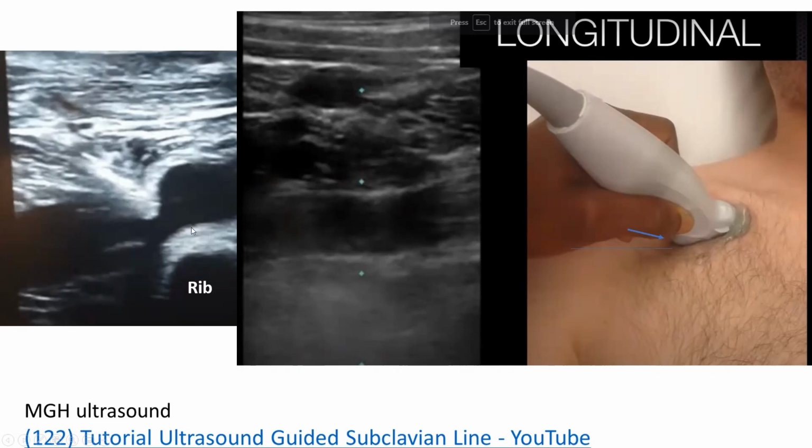You may lose track of the tip of the needle in transverse cut, especially in those deep, thick patients. So longitudinal allows me to keep track of that tip and see where it's entering the vessel if it is getting too medial. This is how we position it, and this is how we should stick. We should stick in that lateral-medial plane at a shallow angle. And longitudinal allows me to stick in line with the artery at a shallow angle and still see my needle. You need about 30-degree angle in this orientation, lateral or medially, when you're doing axillary access.